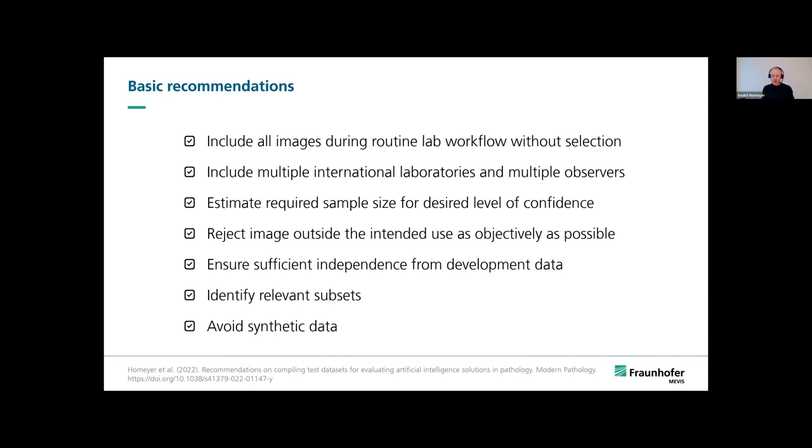So it's never able to cover the entire variability, and will always have certain biases. And that's why we recommend not to use synthetic data for testing purposes, but we would definitely recommend it for training purposes.